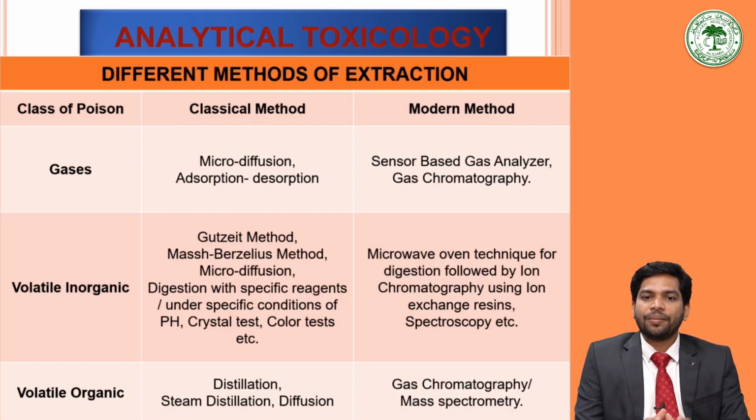So, the small amount of drugs and poisons incorporated into the human body are hidden among the large amount of biological components such as proteins, lipids, nucleic acid, and membranes. It is not easy to detect only the target compound from such complicated matrices. Before instrumental analysis, the extraction procedure is usually essential and very important.